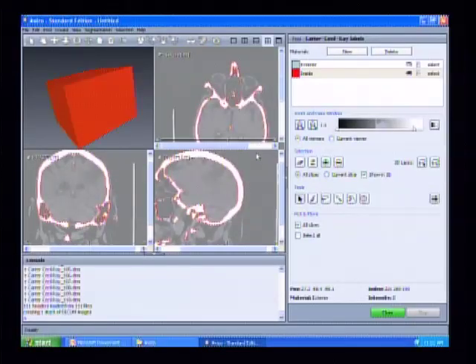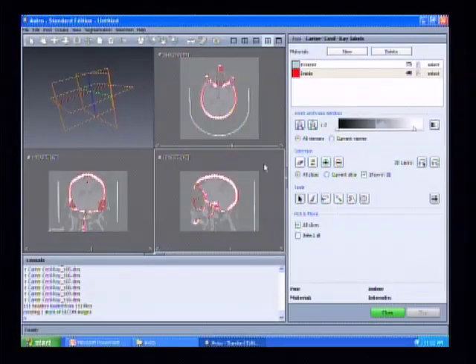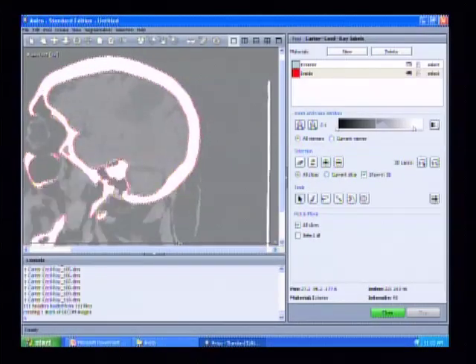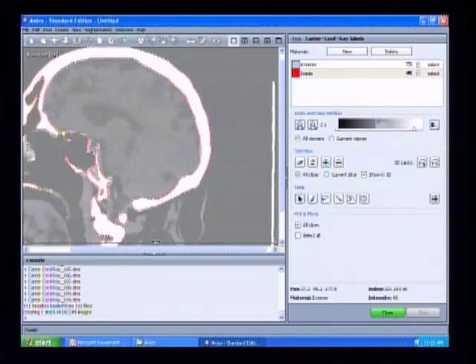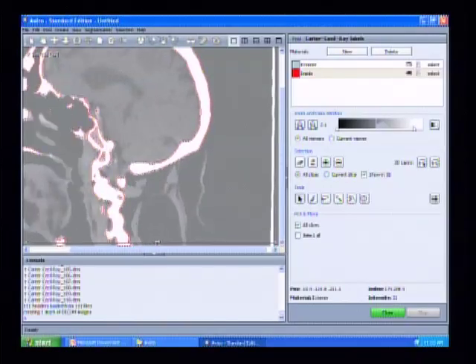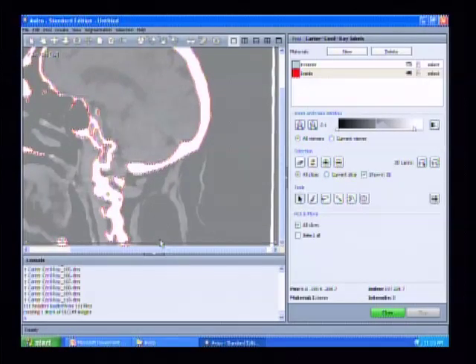You can see, of course, in this bottom view, what is the most difficult when it comes to these live patients: the vertebral bodies really have no separation between the base of the cranium and the first C1 and C2. You can modify your data window a little bit, but we're not really going to do that. So it really is up to the user's interpretation of where the base of the skull ends and the vertebral bodies start. That's going to be the most difficult part.